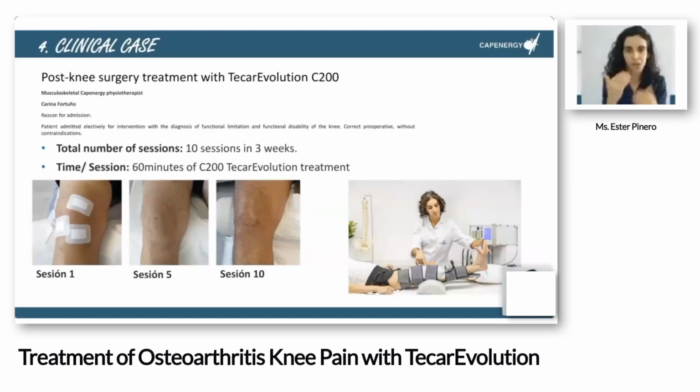It's for that I show you this similar case, because I want you to know that this person, in only 3 weeks, had a very good reduction of the inflammation and a very good condition of strength. We will see right now, okay? Then if you see in the photos, we see the reduction of this inflammation. Another important thing is that all the tissues involved there have been restored.